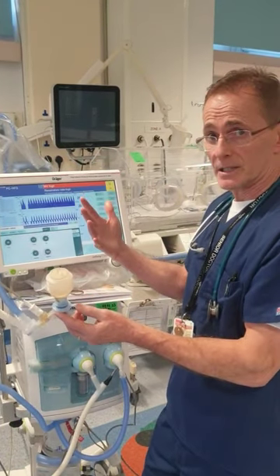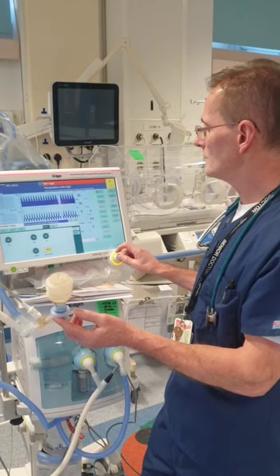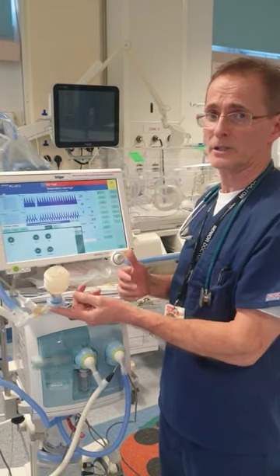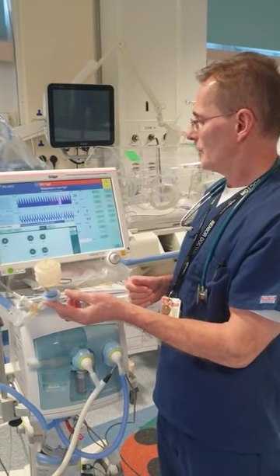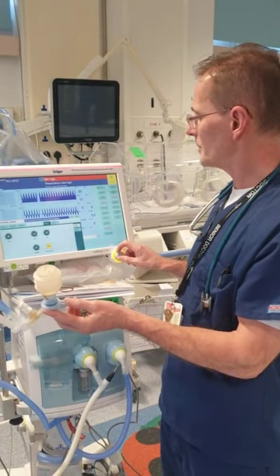Let's say the baby stays well saturated. Another 5 minutes have passed. I'll drop it another 1 or 2 centimeters. Really, it's probably 1 centimeter, but I'm doing this for the purposes of demonstration, rather than take up all your time. Let's say the saturations stay high. Drop it another centimeter.